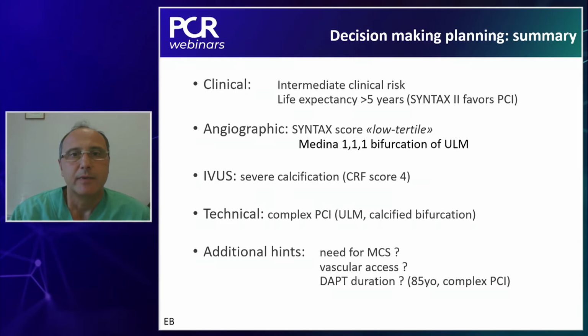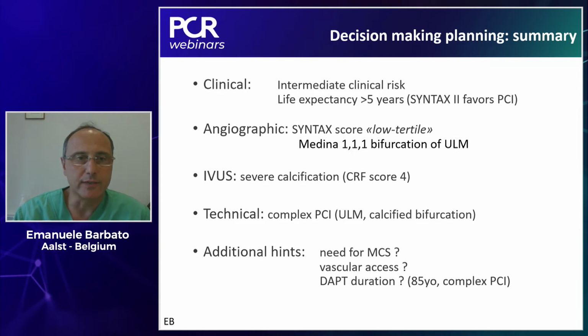Well, let me integrate my answer by using some of the questions coming from the colleagues. First of all, procedural setting. One of the colleagues asked whether femoral approach is a standard approach in this case. So I tell you what I would do. I would always give it a try to do a radial approach if possible. But I give you the word and comment on this specific point.